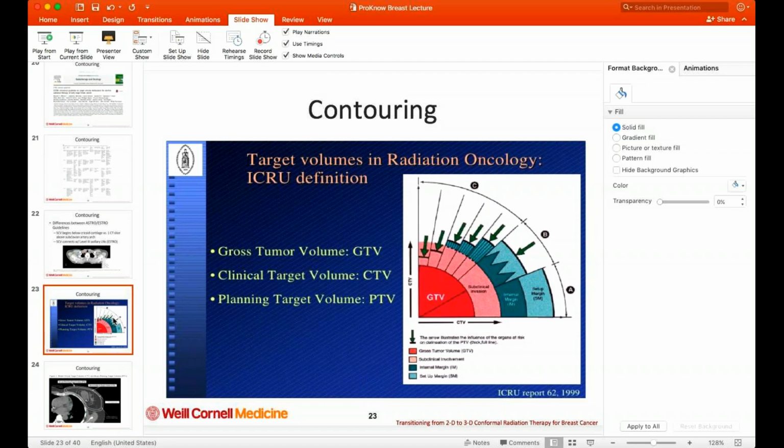Whereas if you're treating someone with a brain cancer, for instance, we immobilize them using a face mask, and that frequently doesn't allow for much motion. So they're more conservative with their CTV to PTV expansions, using anything like 2 millimeters or 3 millimeters, just less, because you're comfortable about your setup. You're more confident that there's going to be less motion.